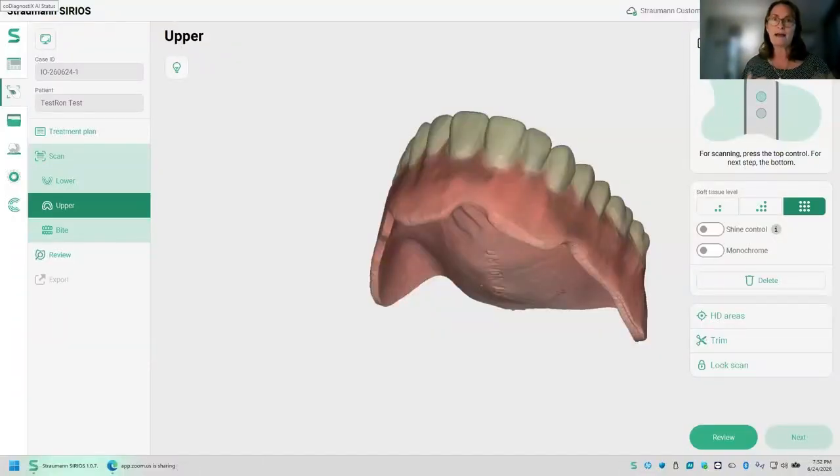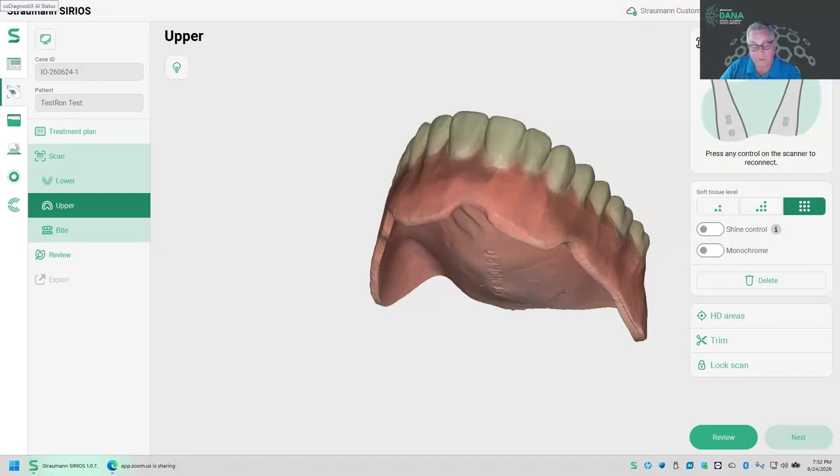Sometimes that's a challenge in describing what do I call it? The good, the bad, and the ugly, right? Here's good, here's bad, and here's terrible, deleted. Scanning technology has come so far. The first intraoral digital scans were taken in 1986? Okay. Actually, here we are in 2026, so we're 40 years later. This technology has come so far, but just like polyvinyl siloxane, you still have occasional imperfections in the scan.